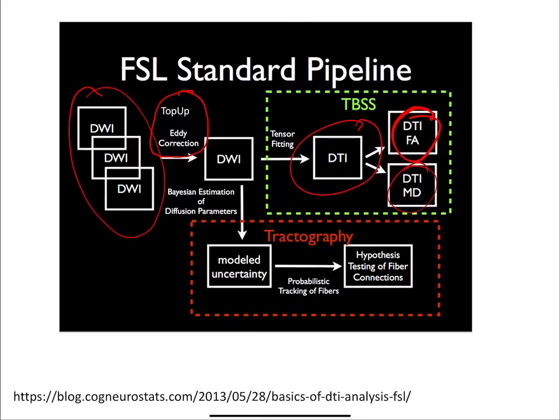And then if you have more time, you can run bedpost and the tractography and all the more sophisticated things. But you definitely want to do DTI fit, do your diffusion tensor imaging analysis very quickly, and then you'll be satisfied that hopefully at least the data is reasonable quality, and then you can do the other more sophisticated analysis later.